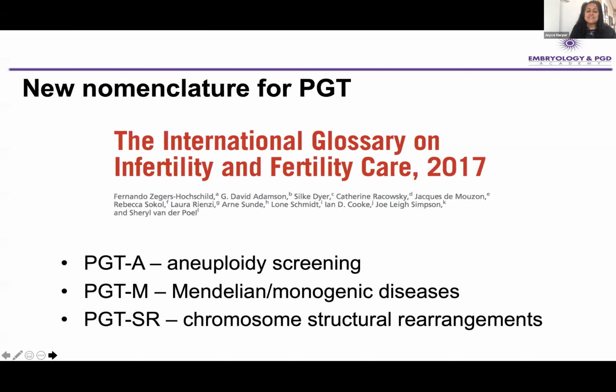And then a few years ago, a group got together and decided to rename this. So we've had to get used to calling it now PGT.